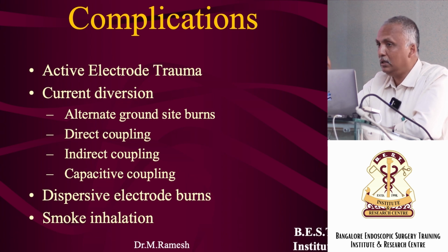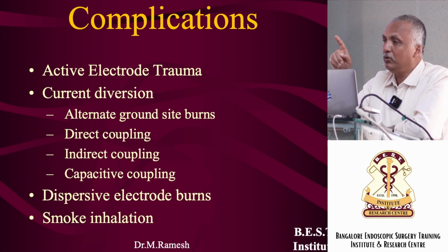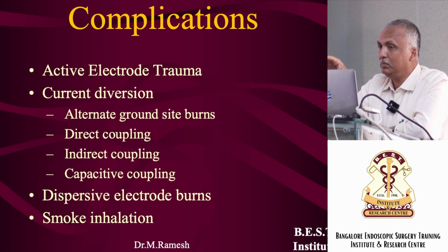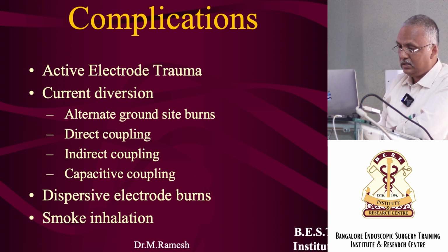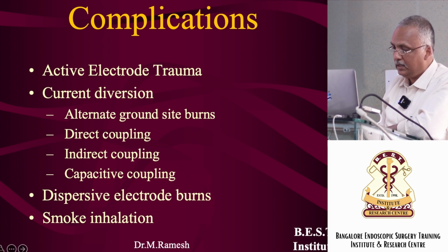You need not have 100% applied. Even if 75% of the plate is touching, you will not have burns. If less than 75% is touching, only then you have conduction problems and you can have a burn at the patient plate. But that doesn't mean that you can compromise and say, oh, 80% is touching, let me go ahead. That should not happen. And another complication, especially for surgeons, OT technicians, nurses and the anesthetists, is smoke inhalation in the operation theatre.